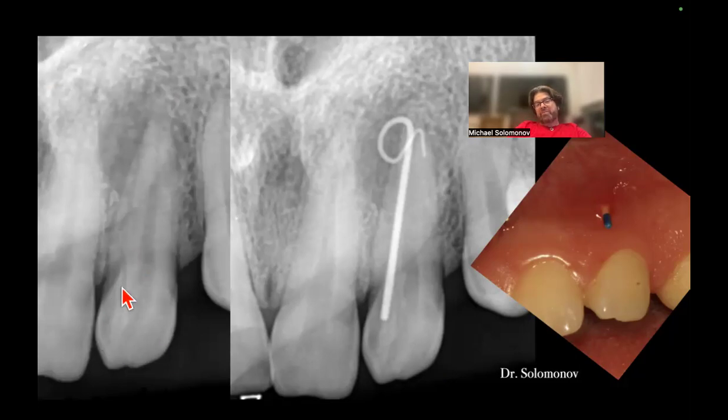What I had here is a rare anatomical situation. It's dens invaginatus, classic in an upper lateral. And of course, when we have a complex anatomy, it's a reason for a CBCT scan. Okay, here we see very well this dens.